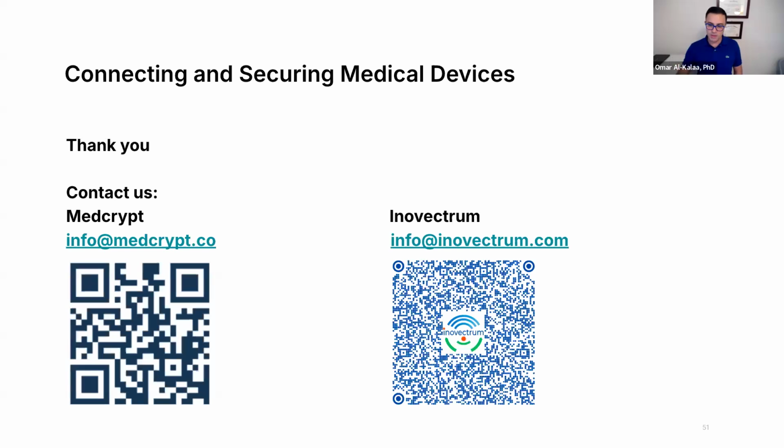When you're implementing any type of cryptographic function within your device, you should start by looking into the known vulnerabilities for that function and whether you have addressed those. And if there are, then probably you shouldn't be using them, because most likely the adequate action to take is not to use it and use the better version. Naomi, anything you'd like to add?